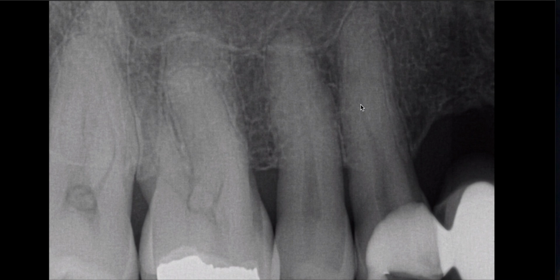I was thinking up front, wow, maybe these are 3 canals, 2 buccals. Maybe that's a PDL there, maybe that's a PDL there, and definitely there's a PDL there. But it turns out it wasn't. But it's something to look for.